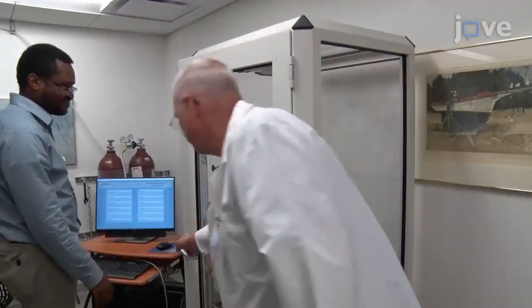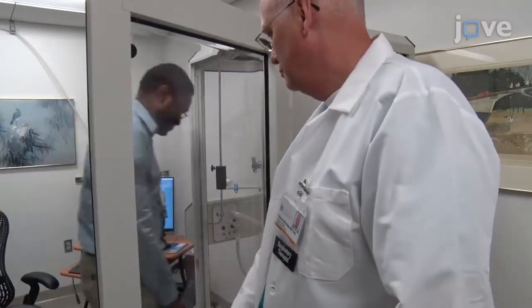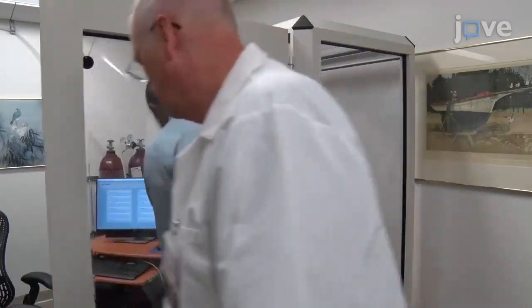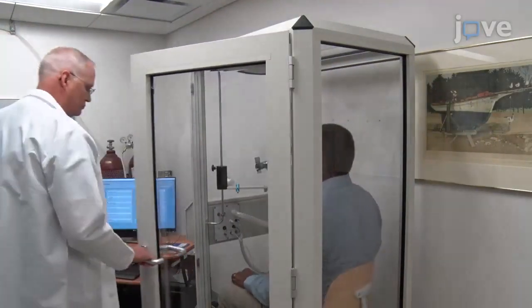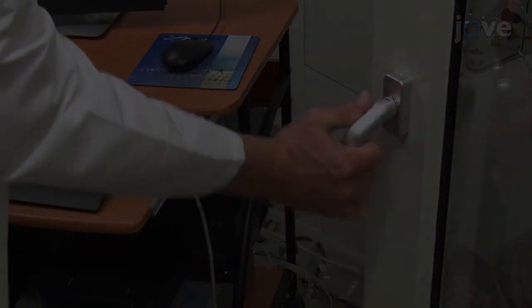Immediately prior to the Plethysmography measurement, have the participant enter the whole body Plethysmograph and close the door.